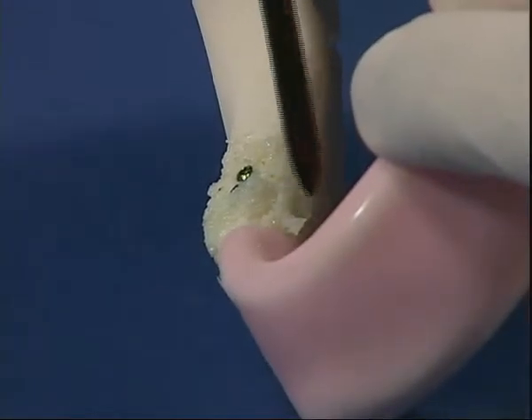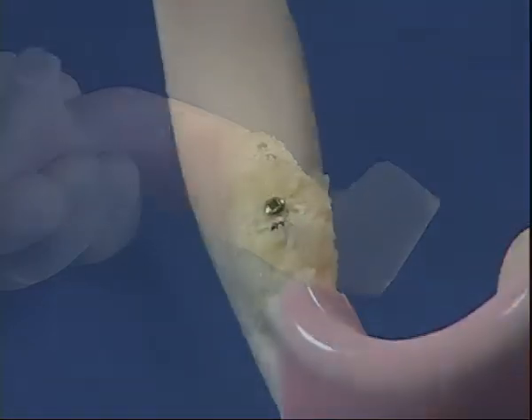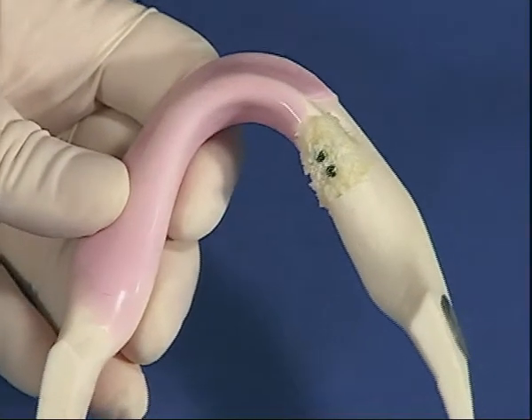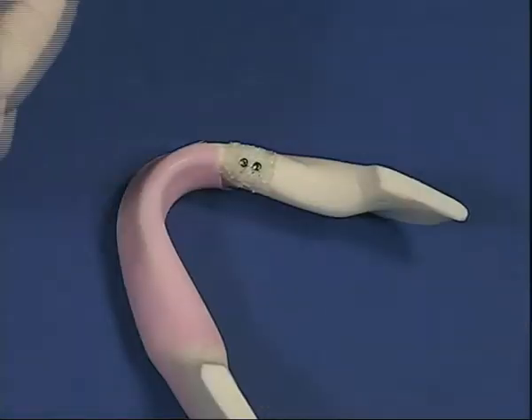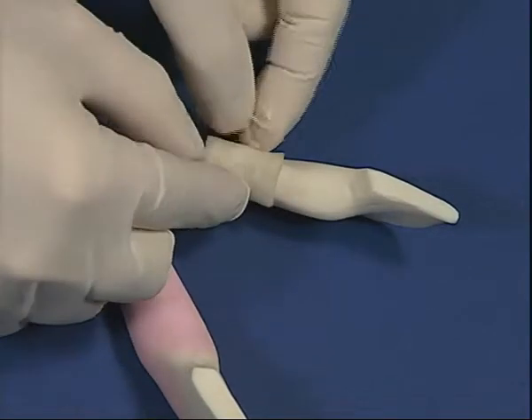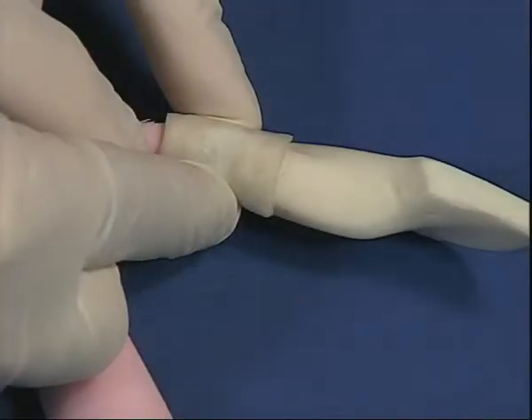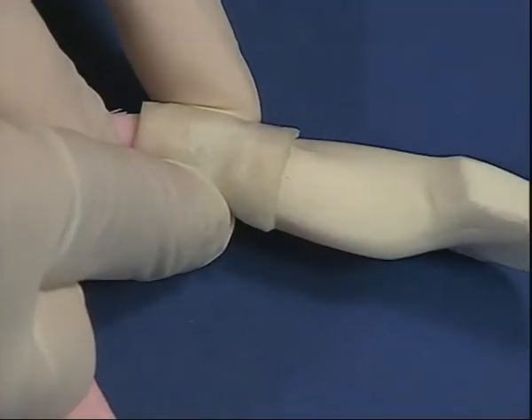After finishing reconstruction, the collagen membrane is laid. As you can notice, the bone tissue block does not have the cortical, which is the compact part that stops the epithelial cells from penetrating. The membrane is used to recreate this condition, a compact surface which allows the passage of organic fluids, but blocks the invasion of the cells.